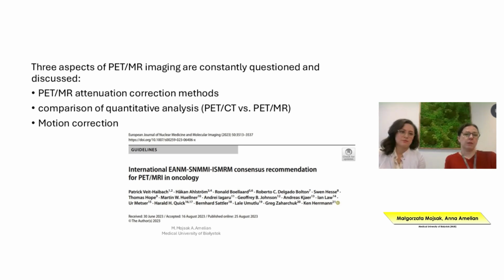Another aspect that is being discussed is comparison of quantitative analysis of PET-CT versus PET-MR. And in 2023, the first consensus and first guideline occurred. It was developed by the international EANM, SNMMI, ISMRM.